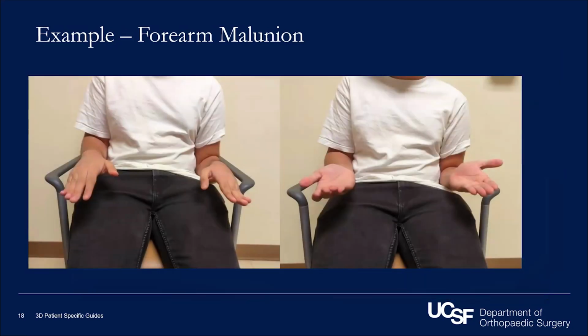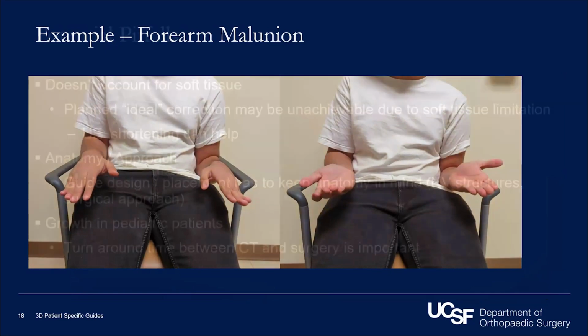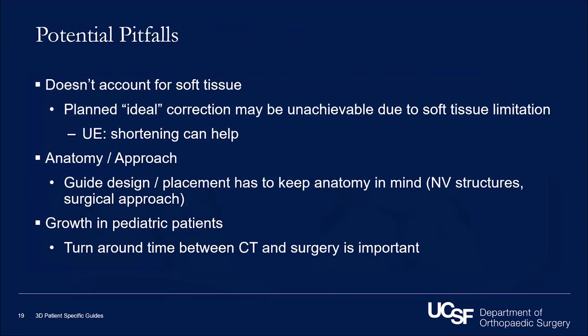And here's his result where we changed the rotational arc a little bit, but overall it's a pretty good functional result. And he's been very happy with that. It's not exactly super easy to do. There are definitely pitfalls here. This type of planning can't account for soft tissue. So I may plan a really ideal correction, but it may not be achievable because of soft tissue limitations, or we don't necessarily get the rotation we want, especially in chronic situations.